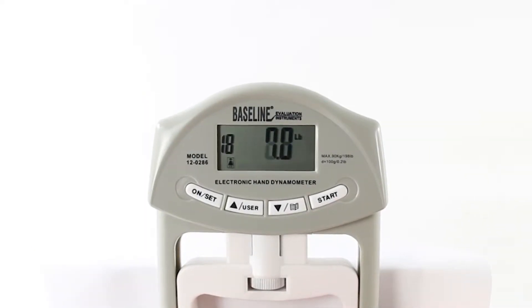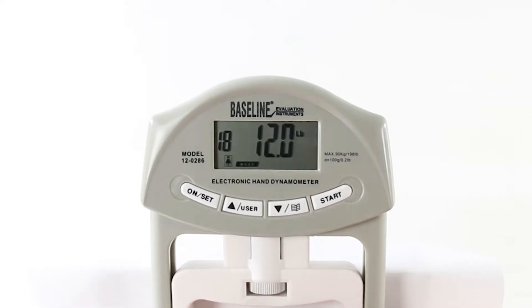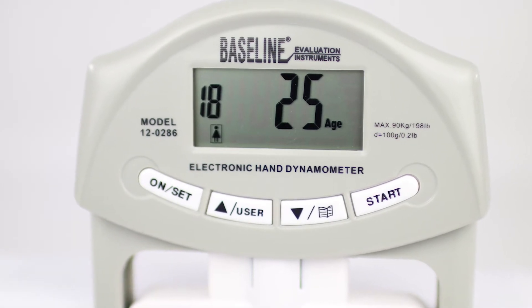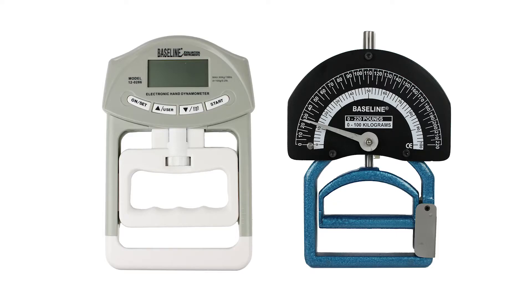The digital model has an easy to read display gauge that accurately displays readings up to the nearest tenth of a pound. It saves and stores results for up to 19 different users for fast retrieval of progress. Contact us for more information today.